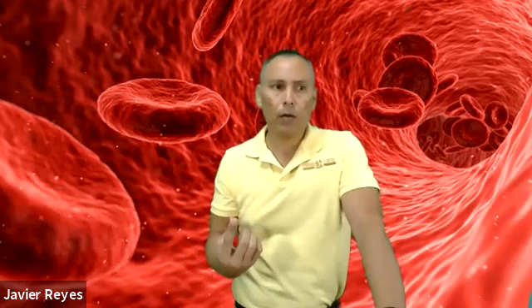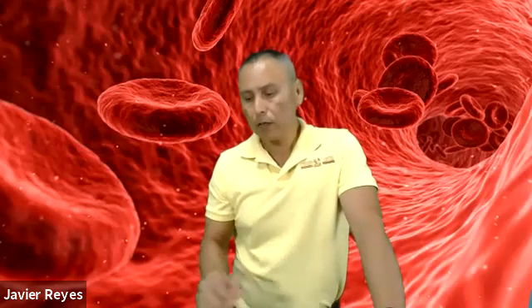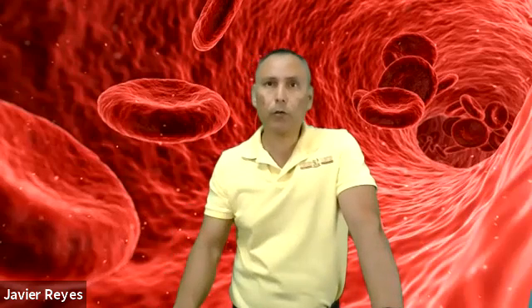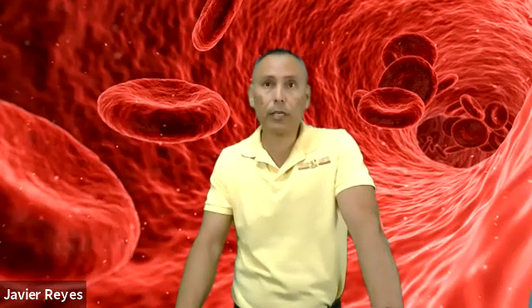All right, so you have no control of it. So what will you do? Well, if you notice this right away, then you should make the selection of the appropriate equipment by using a 10 ml syringe, 20 ml syringe, where you have more control of the vacuum. If the patient has very small veins, again, they will collapse with the amount of pressure from the vacuum. So you make sure that you collect using a syringe method.